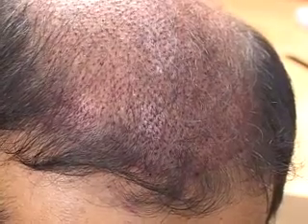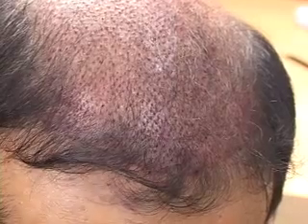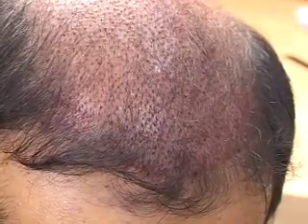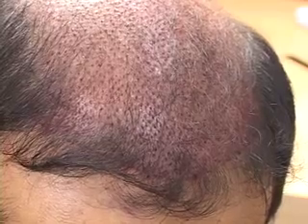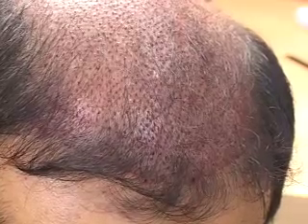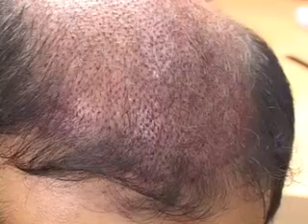We are about 10 minutes out from hair restoration for this gentleman, and what we're trying to show in this series of educational videos is the quality of what we do in terms of hair restoration. As you can see, this gentleman has some hair along the hairline but significant alopecia behind that, and all the little sites you're seeing are created really, really meticulously.